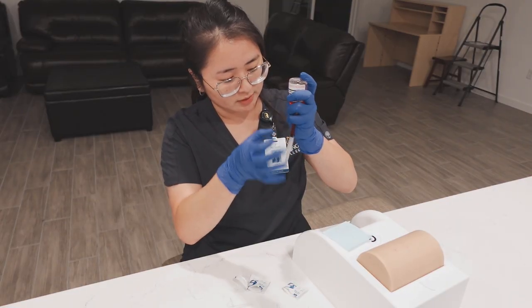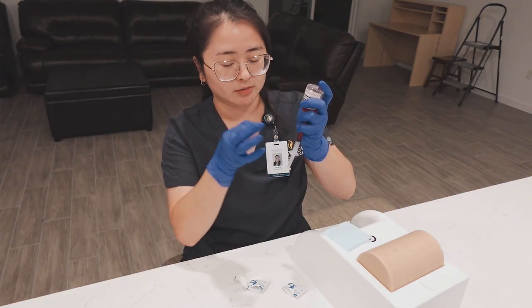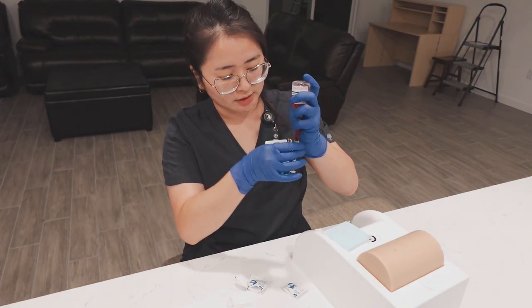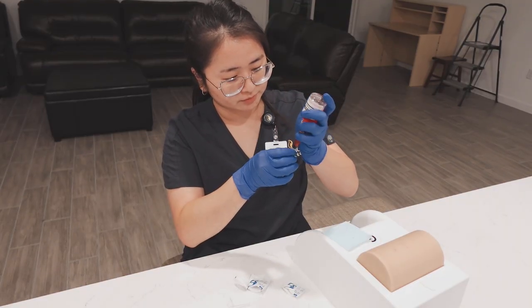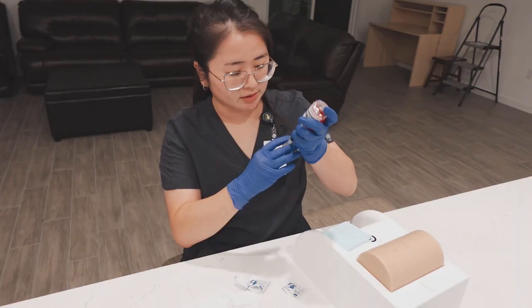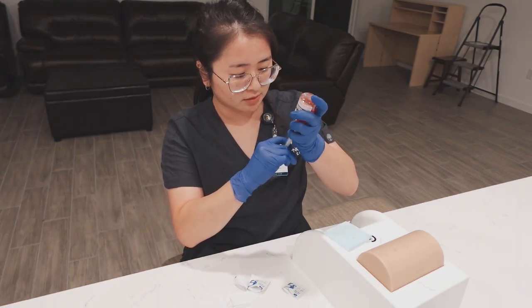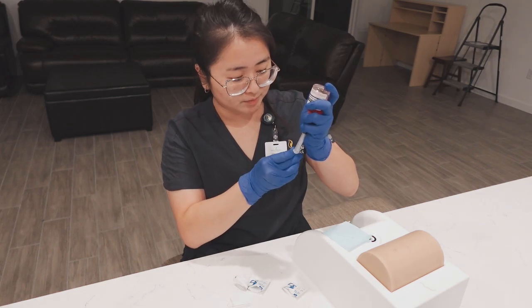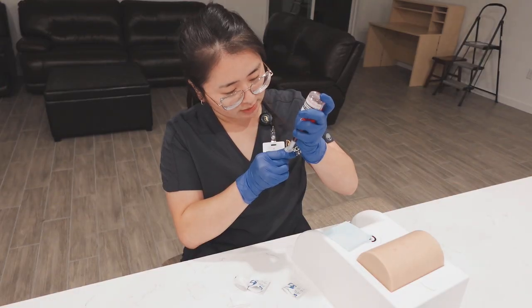So either we will flick the syringe so that the air bubbles come out, or we can inject the medication and redraw the medication.